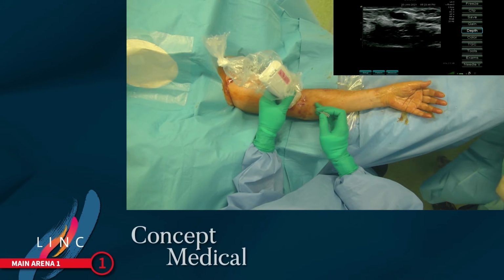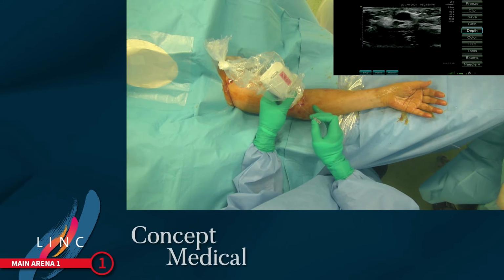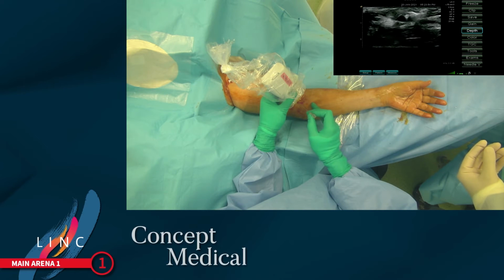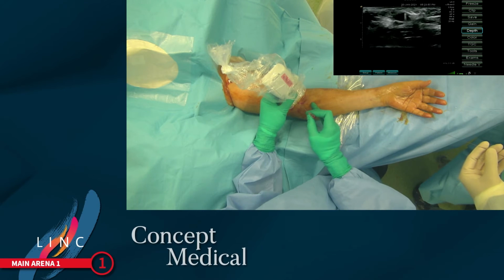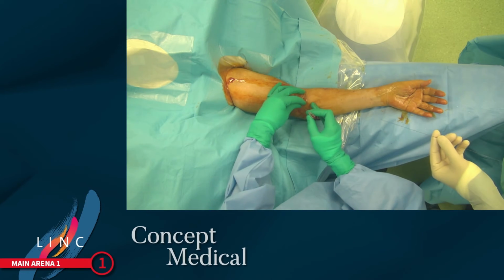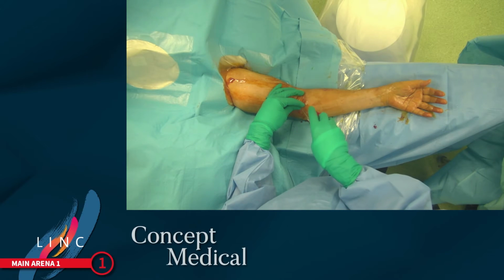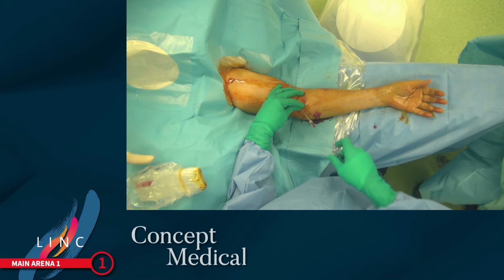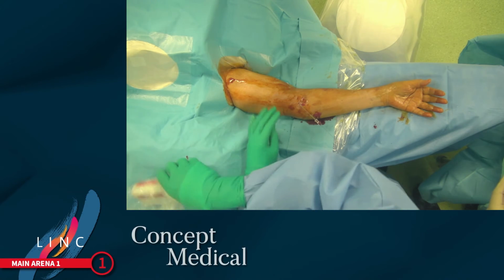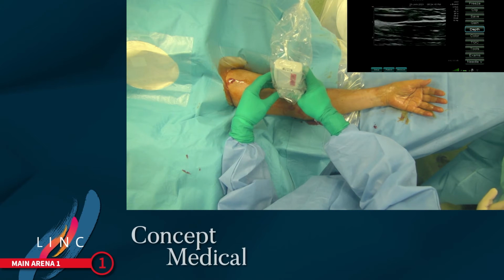Cannulation of the fistula can be done in several ways. I prefer to go uphill in this case, given the location, and using the micropuncture kit you can see over here, with the vein in transverse, making sure we get the 12 o'clock position, and then getting blood back. And using the micropuncture kit, I think, minimizes trauma to the vessel. Of course, with an AV graft, this is not necessary, but in this case, I prefer to be safe.